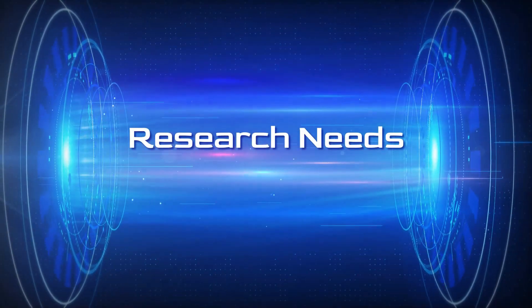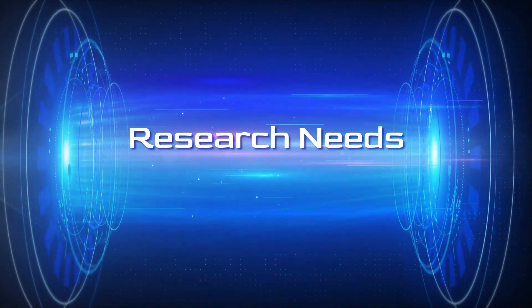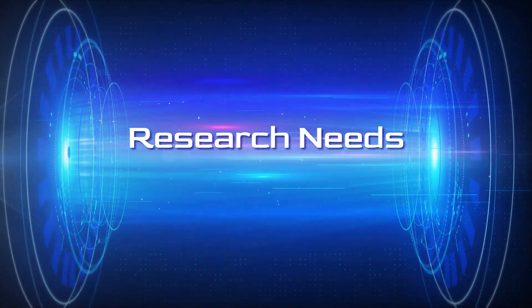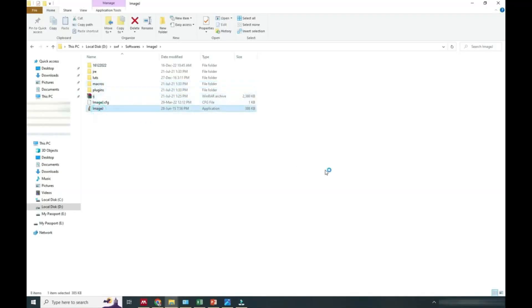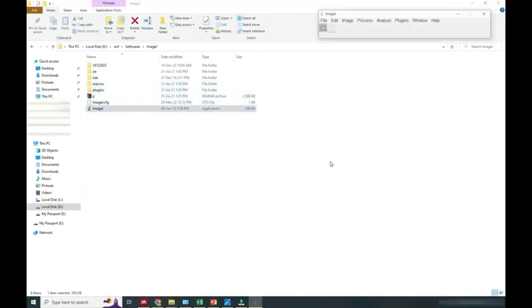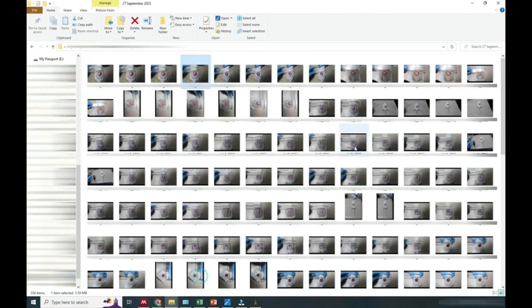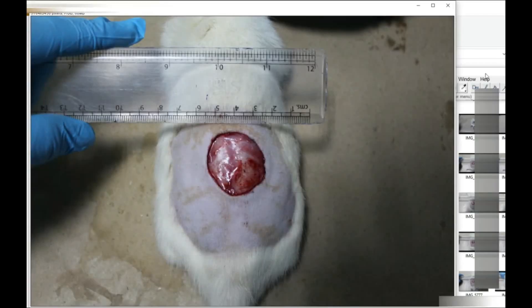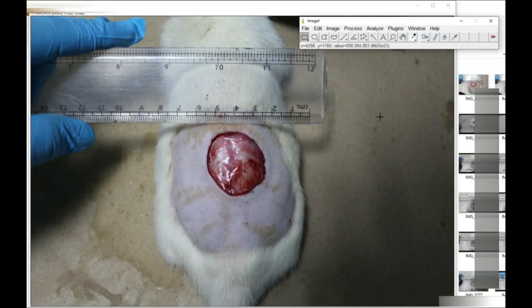In this video we will see how to calculate wound area contraction, or the area of a wound. We will take an image in image software, and you can see we have an image with a scale besides the wound.